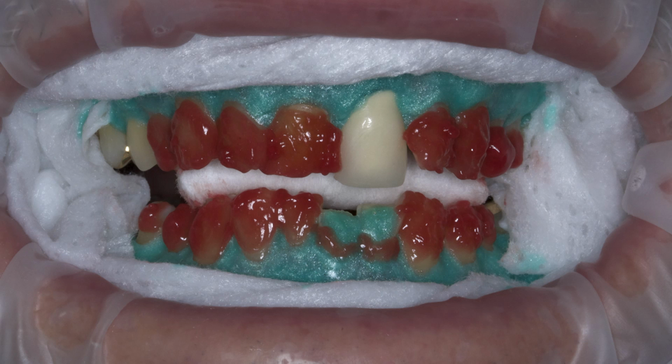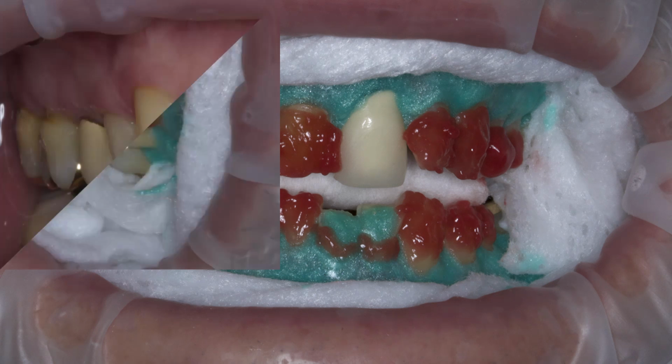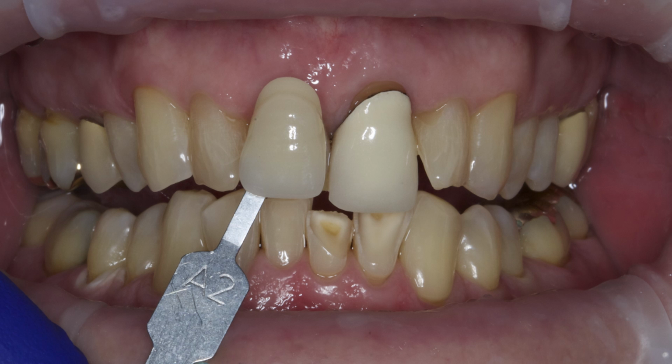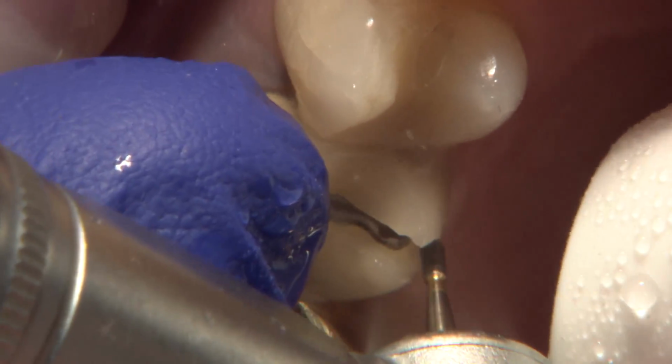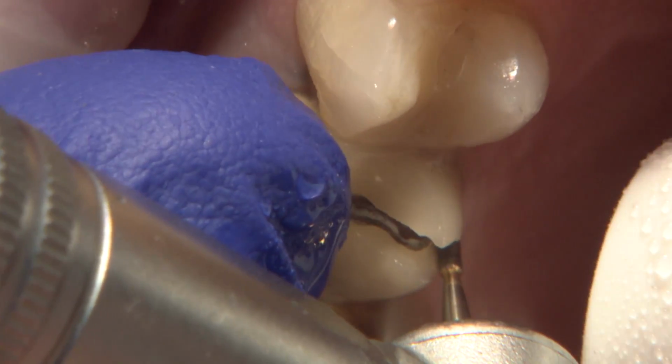Because the teeth may continue whitening for 12 to 24 hours after the bleaching treatment is completed, we wait a couple of days before the prep appointment. We begin our procedure with the removal of the existing PFMs.